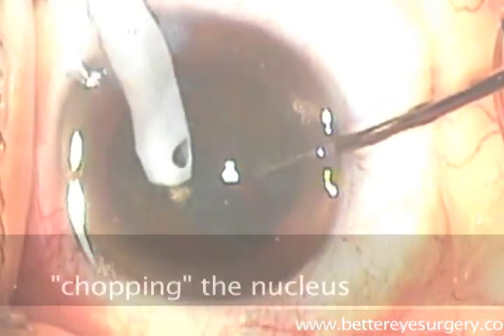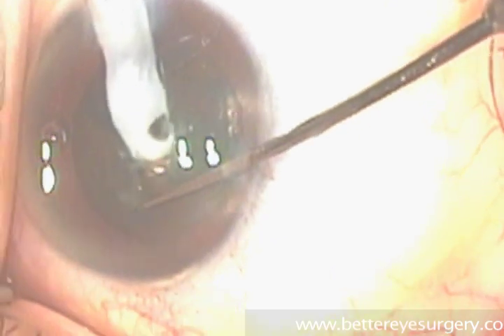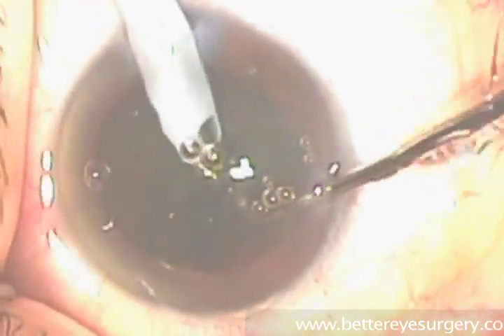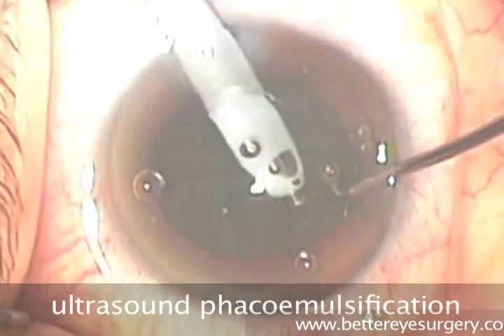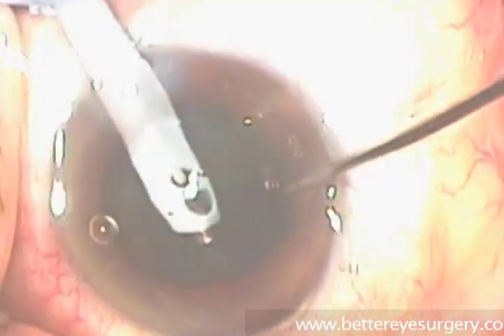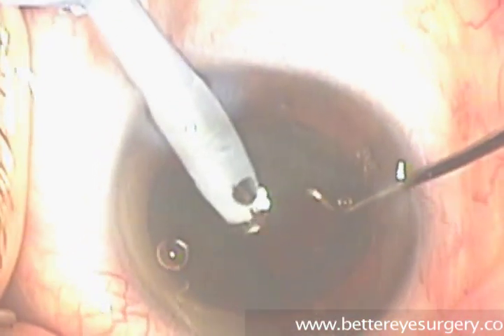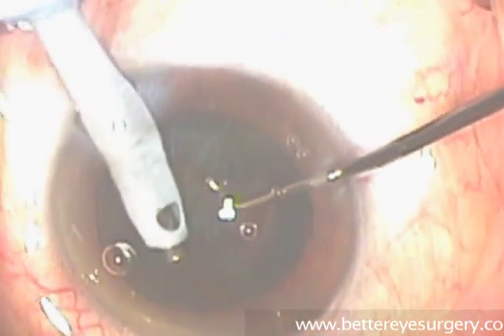Next we remove the lens by chopping it into several segments using two instruments. First is a blunt-ended needle which has a white silicone sleeve around it. This needle oscillates at 40,000 Hz, which breaks up the lens of the eye into tiny pieces. Vacuum, or suction, through the needle allows the pieces of the lens to be removed bit by bit.